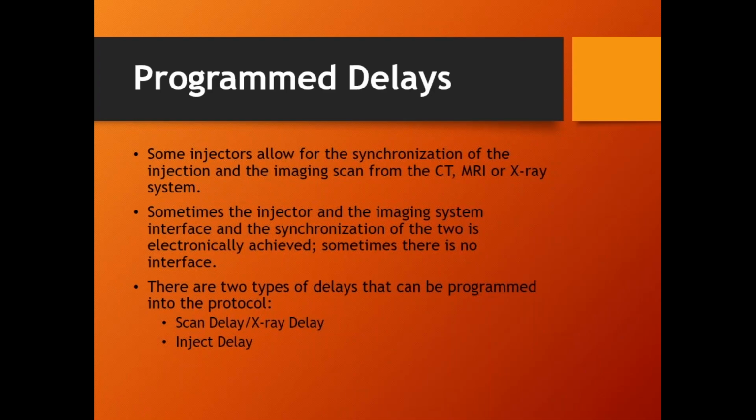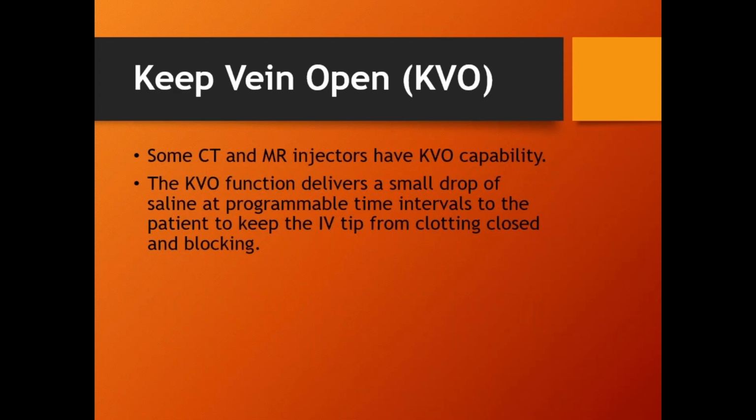Yes, it is. Yep. I was asking about the injection delay in my head. What was the purpose? Why is a 5-second injection delay recommended for the check? And that's what I was trying to figure out. I'm like, why? Yep.